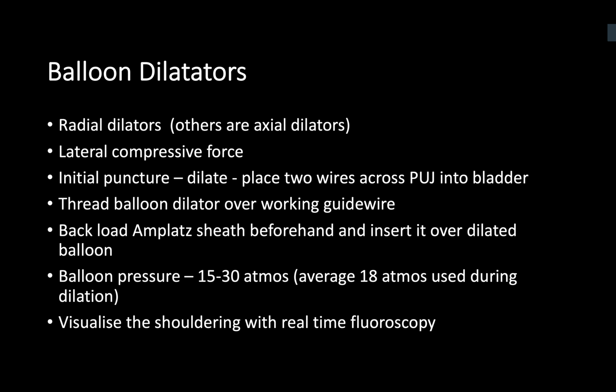And I suppose there may also be a bit of a tamponading effect within the tract from the balloon to reduce the risk of bleeding. Exactly. Well done. So after the initial puncture, using the dilators, we will dilate the tract, and you can use different methods. Finally, there should be two wires.